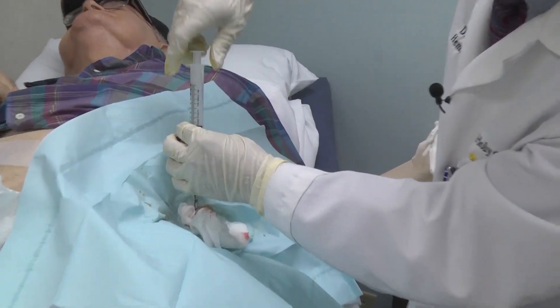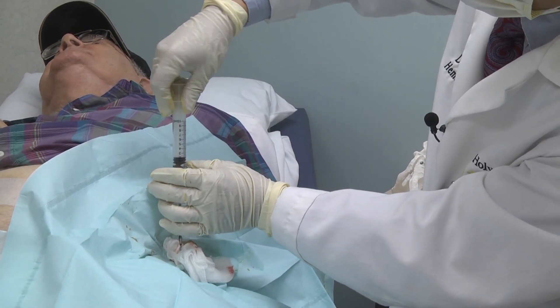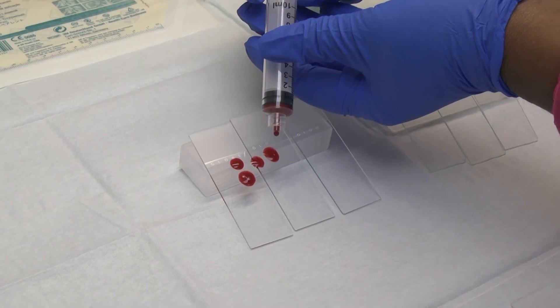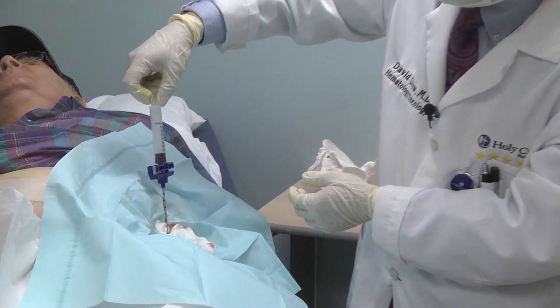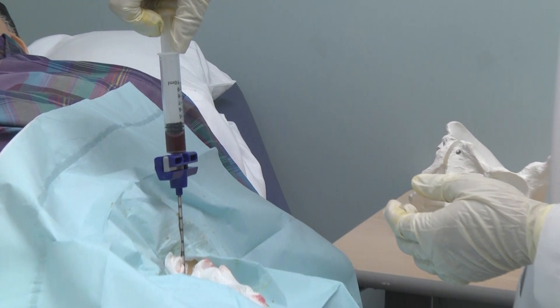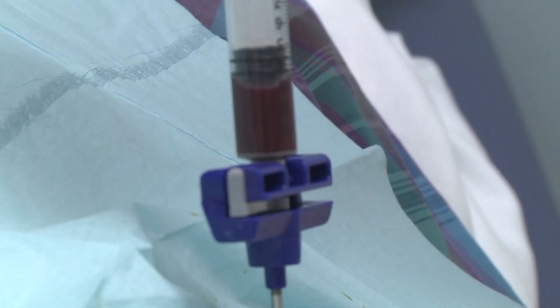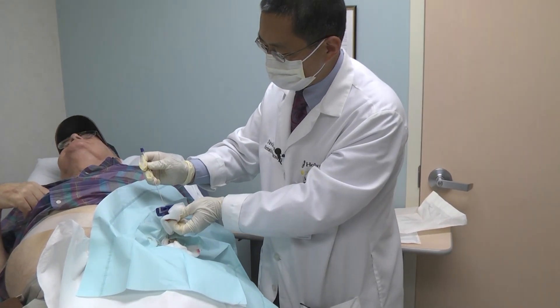First step is aspiration. Try to avoid a big pull — be gentle. Did you feel something? Yeah. Drop for the spicules. That's for the initial spicules. I'm gradually pulling up. When you first start it, you have to go up a little bit. Is it hurting? No, but it feels uncomfortable. Going to four. Get ready. Now the last step — grind your teeth. Is it hurting? A little bit. Put the needle in, then we get the aspiration.